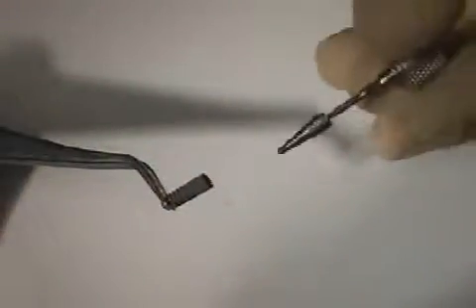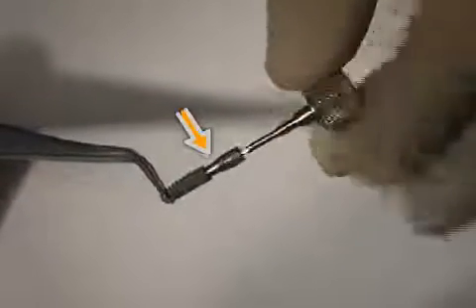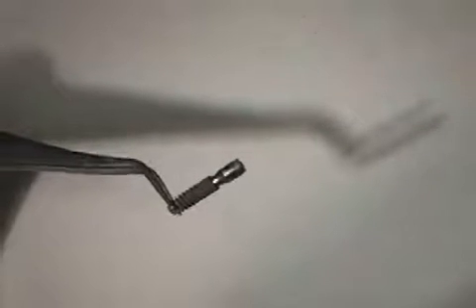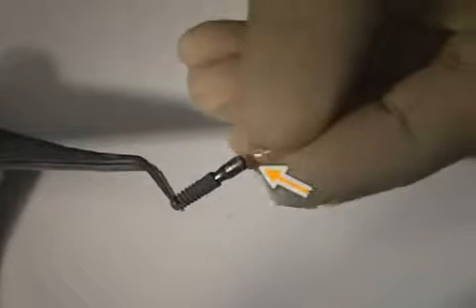For a better understanding, we once again show you how a titanium abutment is screwed onto an implant. The implant, which is usually located in the bone, is held by tweezers. The crown is then cemented onto the abutment.